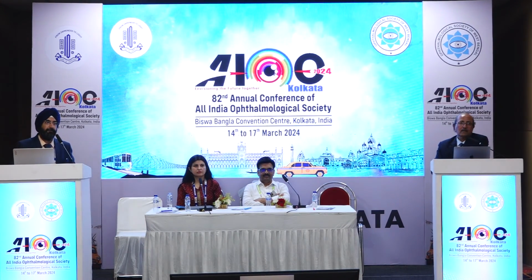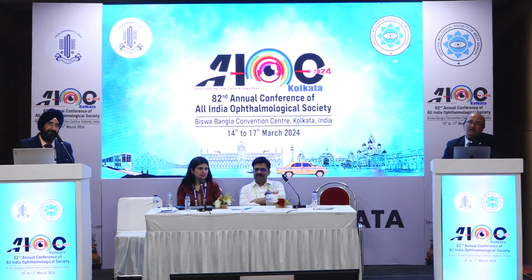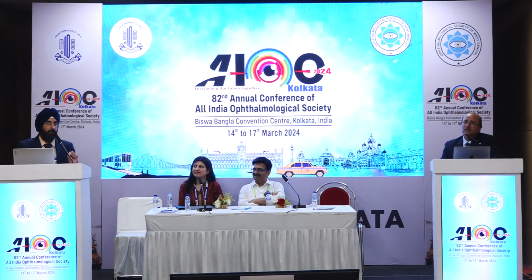I'm a vitreoretinal surgeon, so I go posteriorly with a 25-gauge trocar cannula, and after I put the lens, I do a PCCC with a cutter and an anterior vitrectomy from the pars plana. What happens in children is the pars plana is not really developed. That is the issue, so you don't know where you are going. The other thing is, yes, the advantage is that the traction is much less. If you do it from the anterior route, you are going to create a little traction on the vitreous. But with the pars plana, the advantage is you are not creating traction.